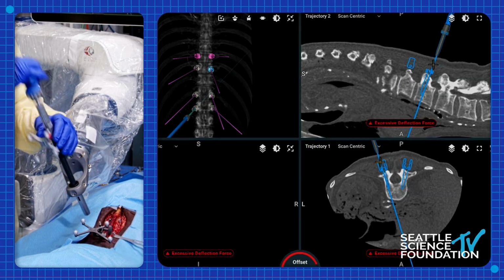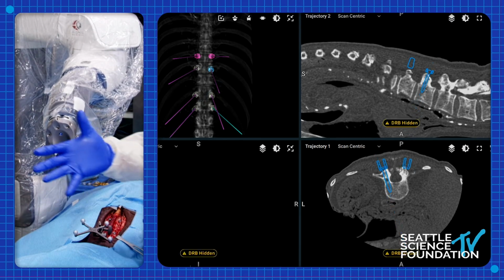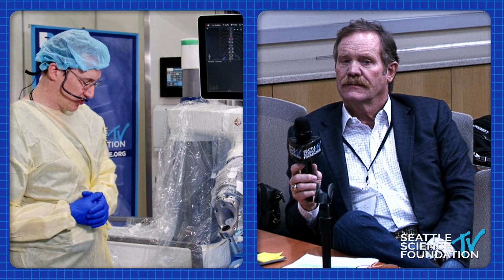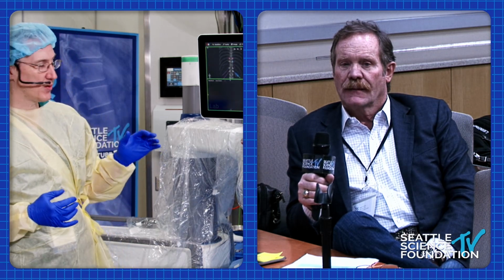Yeah, I absolutely agree. Chance fractures, what a great case for this technology. And yeah, I appreciate that. That's absolutely true. I have found it to be very helpful in the deformity, and Dr. Kent, who was mentioned earlier, has really pushed the envelope in what we can do with deformity corrections. And I've found that this technology can be very, very useful in that, particularly because you can plan your corrections and execute them with consistency and pretty quickly.